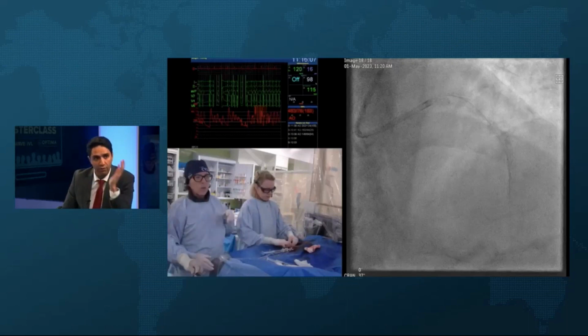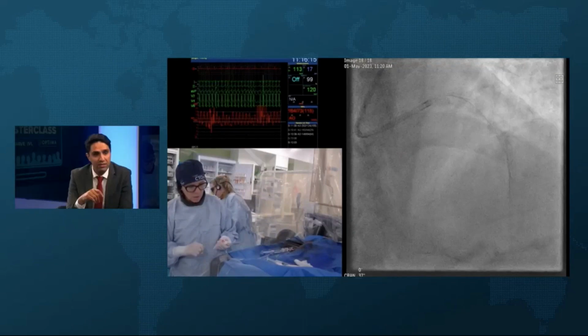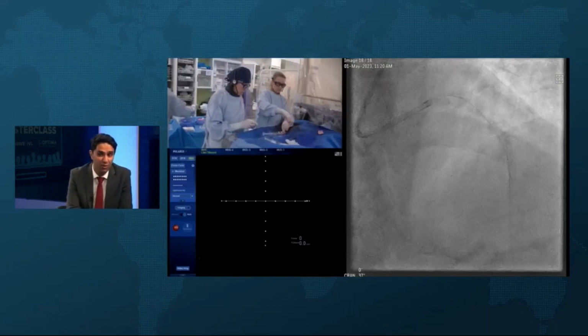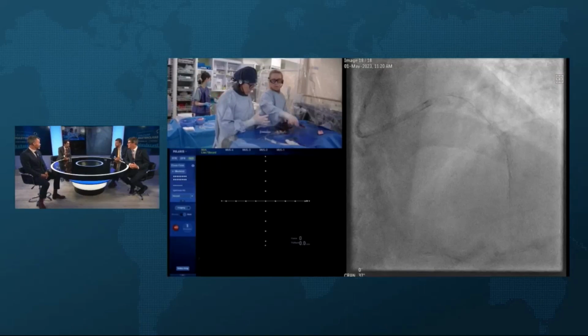What's been the experience with imaging with these? What's the deep OCT system? Yeah, I mean, it's preliminary. We've done 25 cases. SpectraWave is now FDA approved. Exquisite image quality. 1.1 second pullback for 10 centimeters, right? So it really revolutionizes saline guided PCI rather than using contrast. And if you are going to use contrast, you need 3 or 4 mils because it's a 1 second pullback. And the resolution, after reviewing 20,000 OCTs, there's stuff on those I don't even know what it is. So it's an exciting time for imaging.